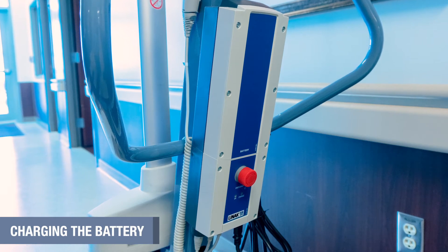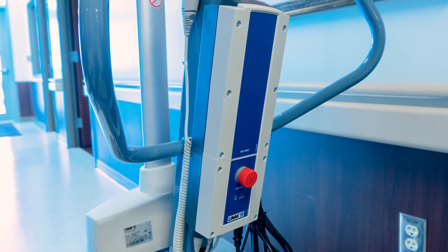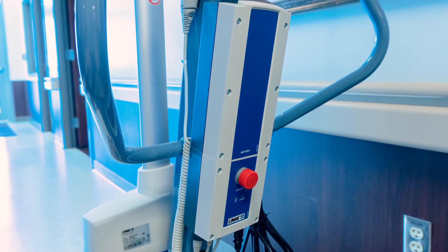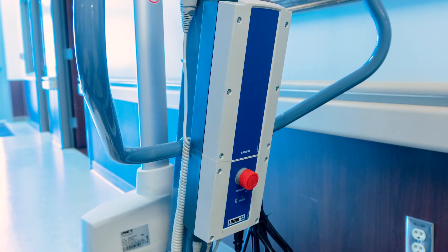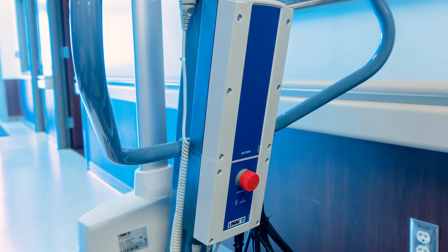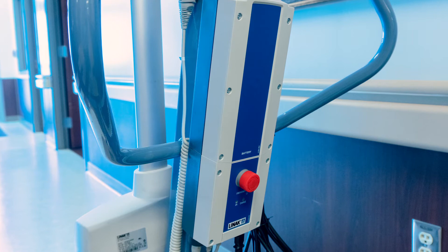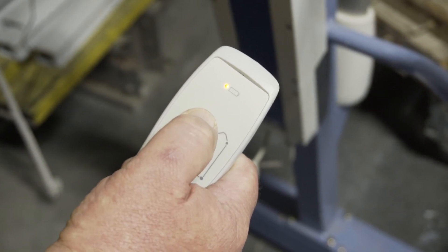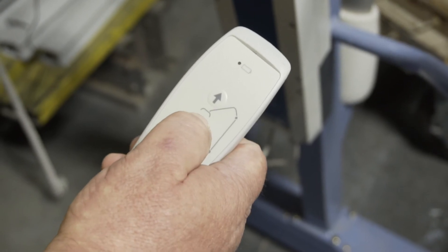The Classic Lift is equipped with onboard charging and one battery pack as standard equipment. When the battery on the EasyWay Classic Lift is discharged, the control box will alert the user with a beep when the up or down button is pressed, and the LED on the hand control will turn yellow when the up or down arrow is pressed.